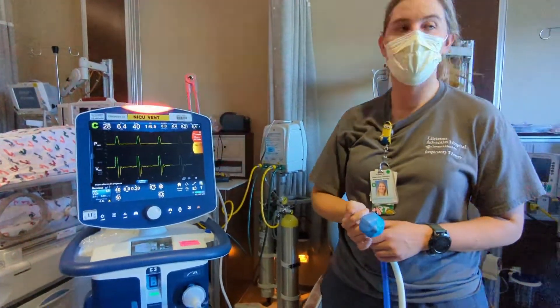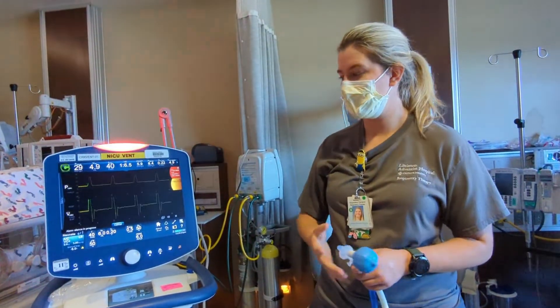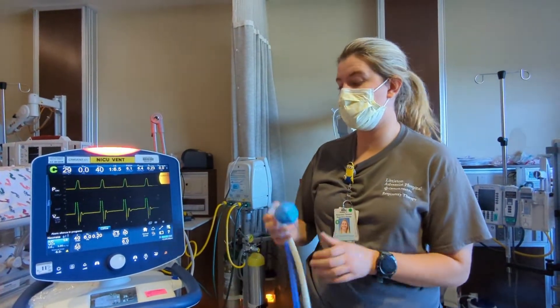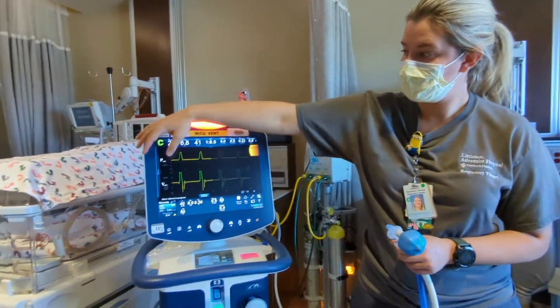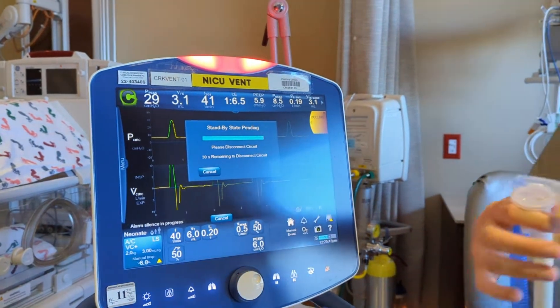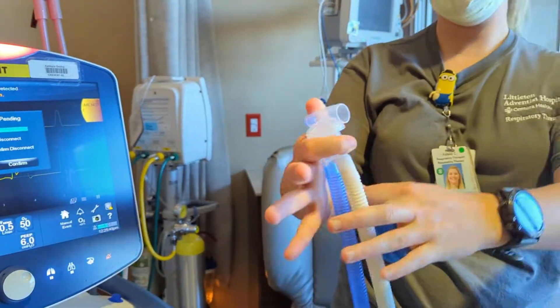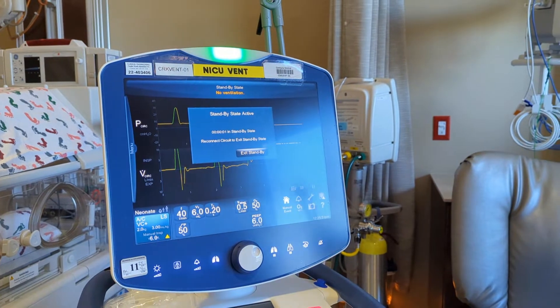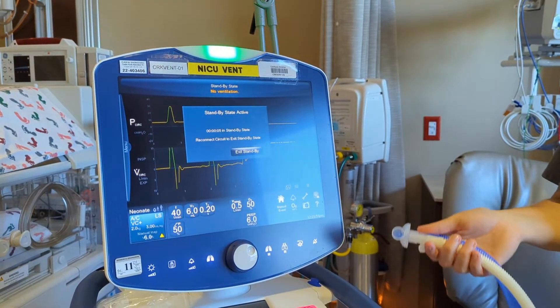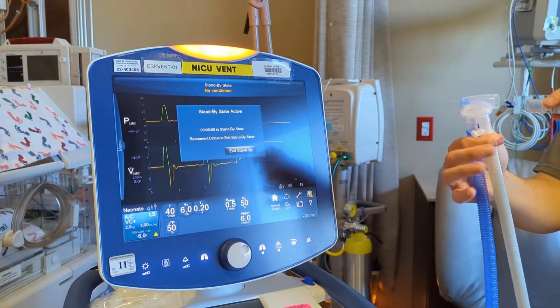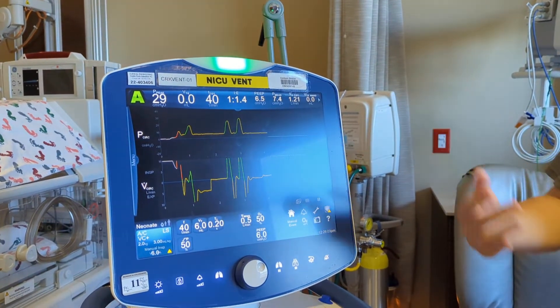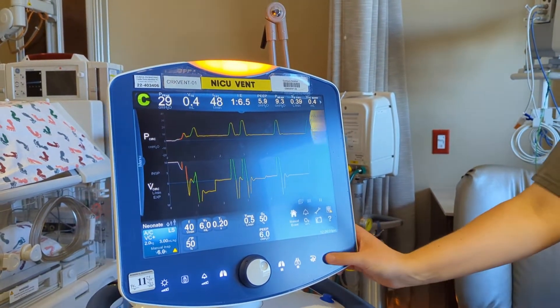If there's an instance where you need to take your baby off the ventilator, there is a way to not completely shut it off. Click on the menu here and you'll see the standby button. Click standby, disconnect the baby, and hit confirm. When you come back and reconnect them, it will detect their breath and ventilation will resume at the current settings.